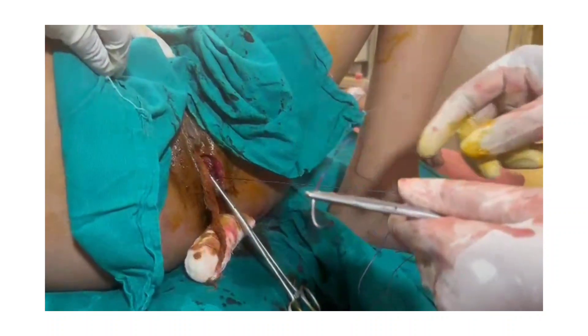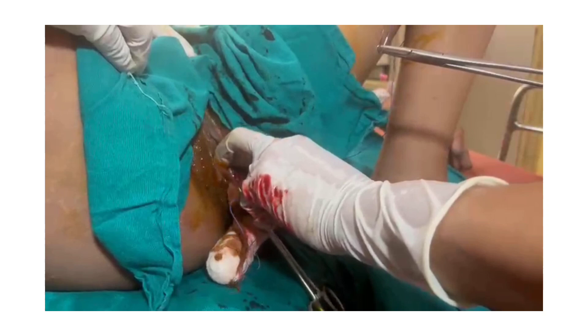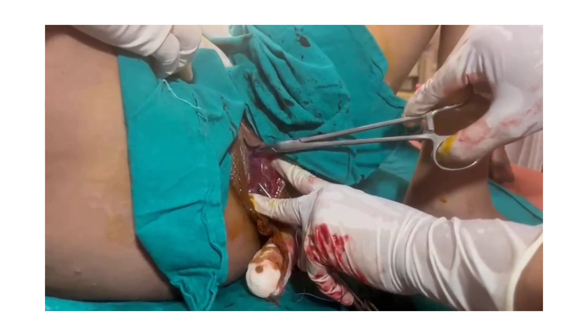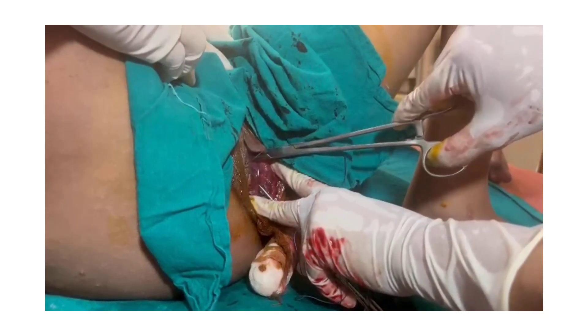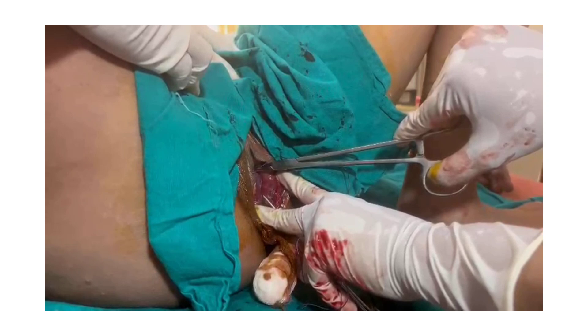I am demonstrating suturing of an episiotomy — a mediolateral episiotomy. Always locate the apex. This is the apex of the episiotomy wound. I am probing with an instrument and the first stitch always goes 1 cm above the apex.